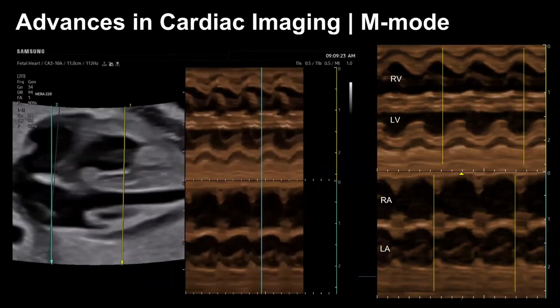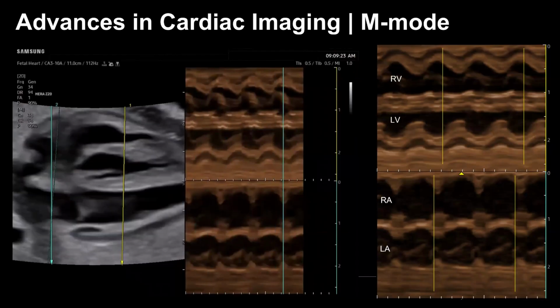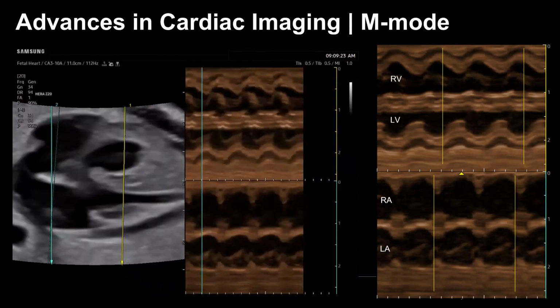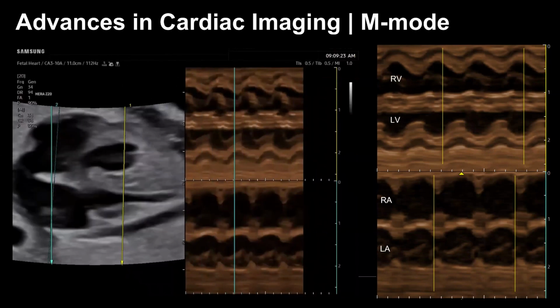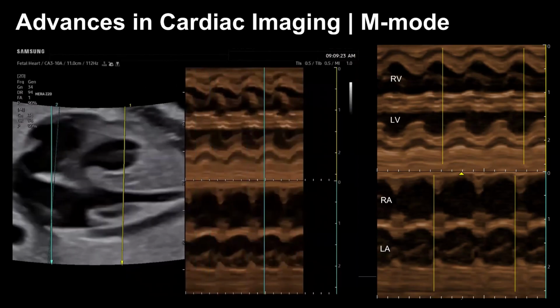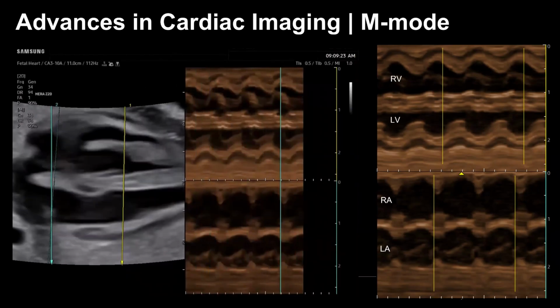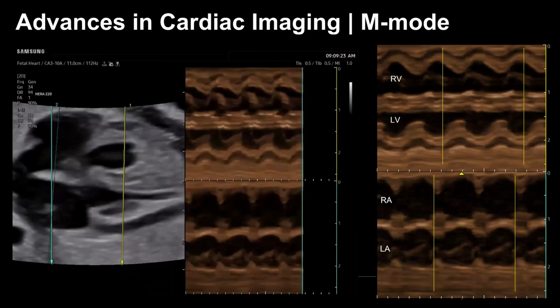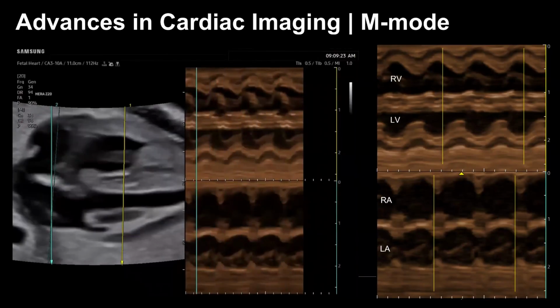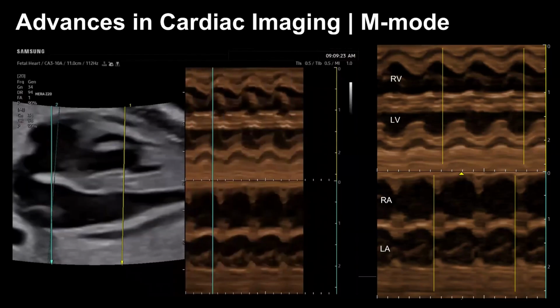That's a really important difference, because the heart rate alone doesn't tell us anything if the atrial and ventricular contractions are actually associated. This is very important to document that it's normal, and important for the differential diagnosis of different anomalies of the cardiac rhythm.